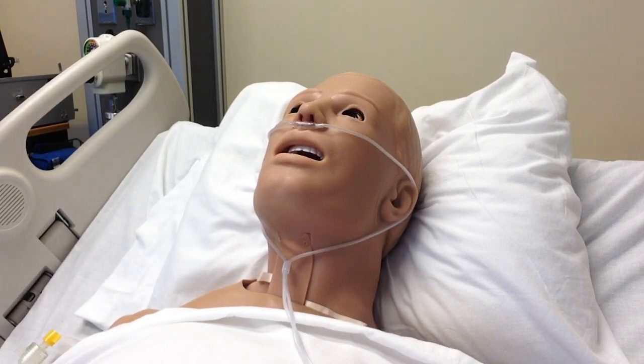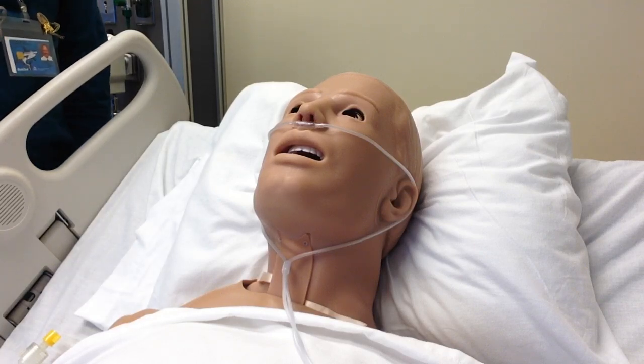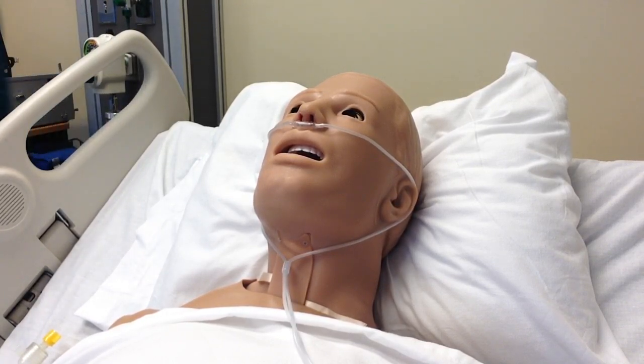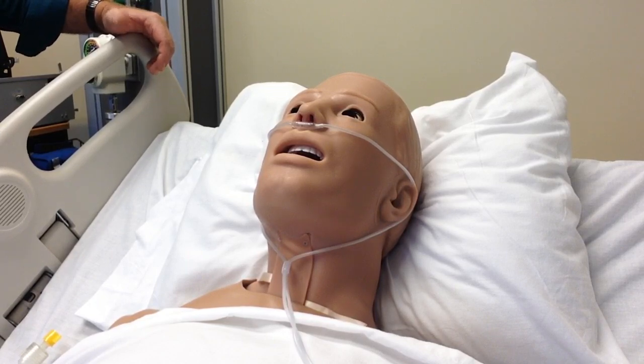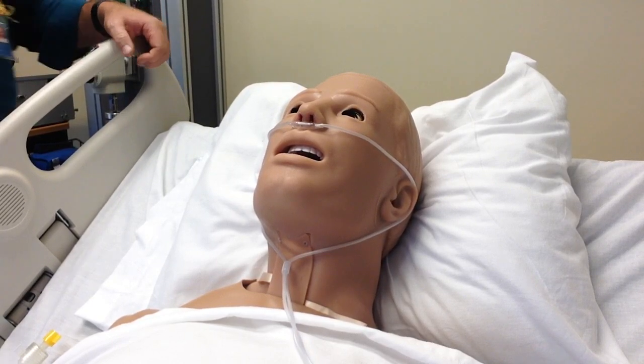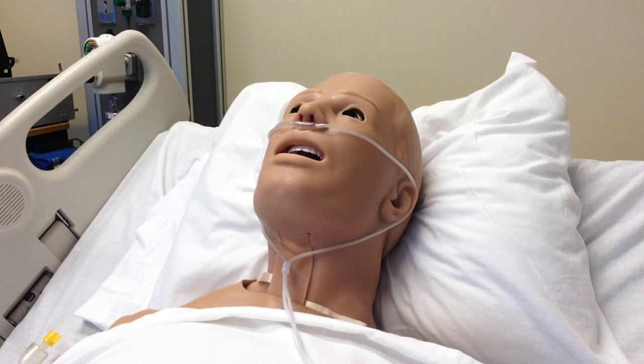If the patient becomes tachypnic or in distress, then the approximate FiO2 will go down because you're blending in more room air. If the patient becomes bradypnic or their breathing pattern severely slows down, the approximate FiO2 will increase because they're not breathing in enough room air. If the patient becomes short of breath or has a higher oxygen demand, then you may need to switch them over to a device called a Venturi mask, which we will be covering. This is the nasal cannula for an adult.